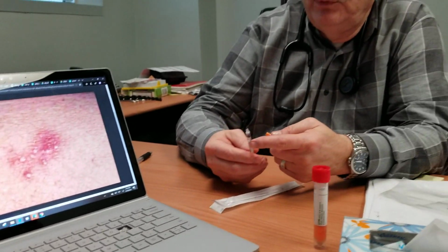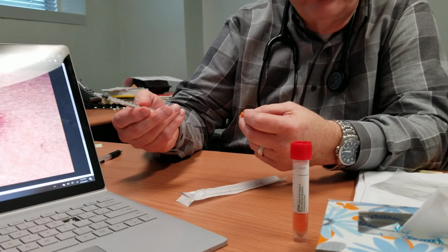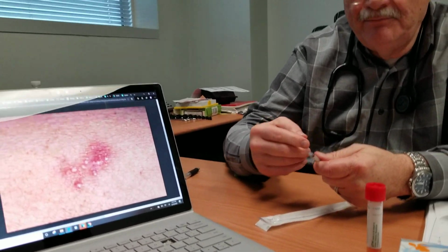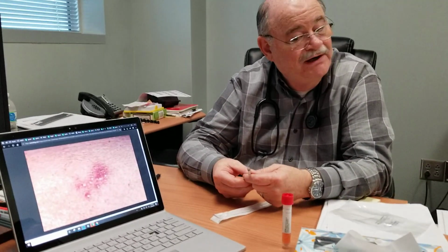The only problem with even a small needle is the amount of fluid that's in the vesicle is relatively small, and if you just use air to try and express it out of the needle, it may not be effective in getting the culture actually out of the needle.